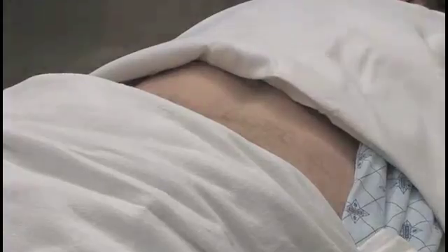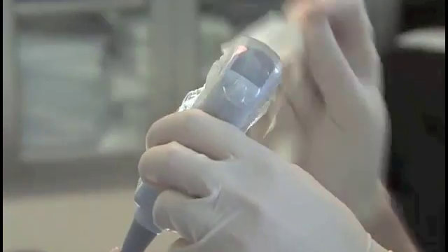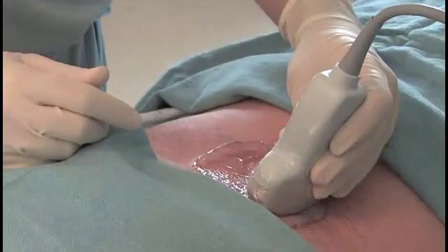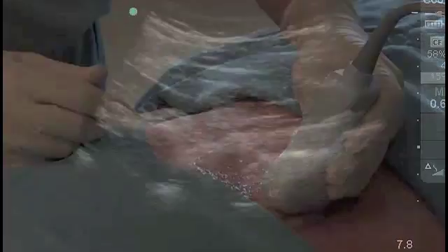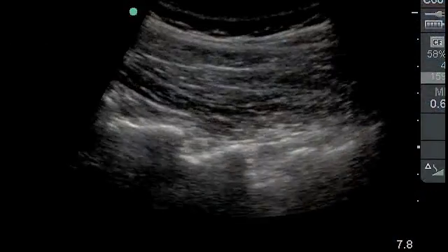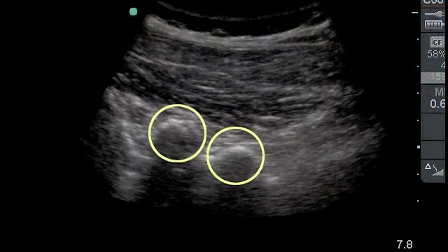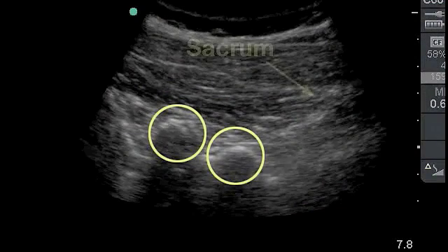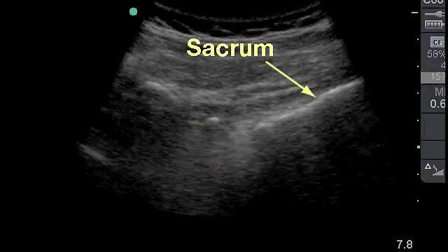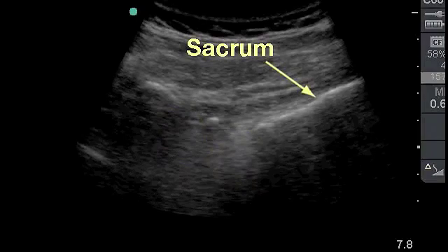The patient is placed prone with the abdomen supported by pillows to compensate for the natural lumbar lordosis. With a curved array transducer covered with a sterile probe sheath, the lumbar segments are identified in the longitudinal perivertebral plane. Lumbar transverse processes, visualized as highly echogenic rounded signals on ultrasound, can be counted moving cephalad from the superior border of the sacrum.